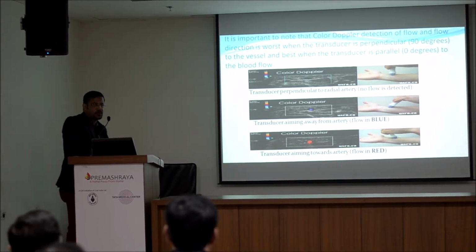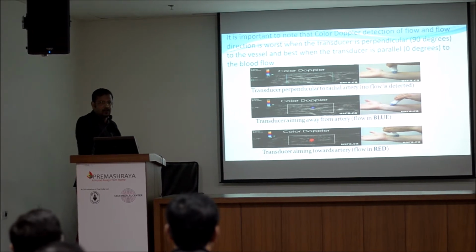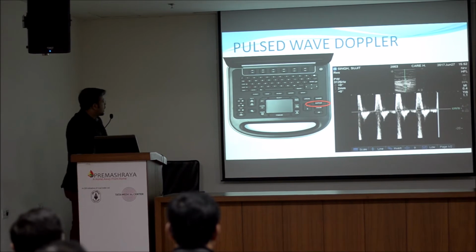So don't get confused that the blue which is looking is the vein. In regional anesthesia, it's different. Okay? Clear? Now pulse wave, doctor.